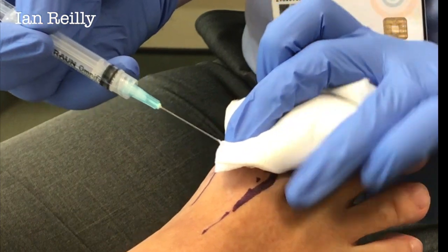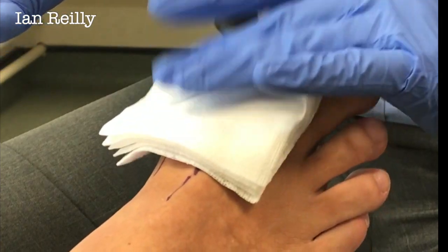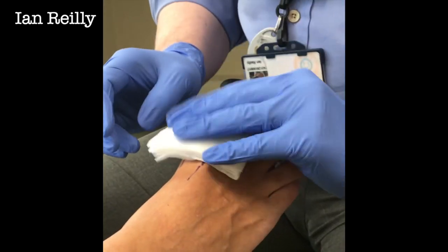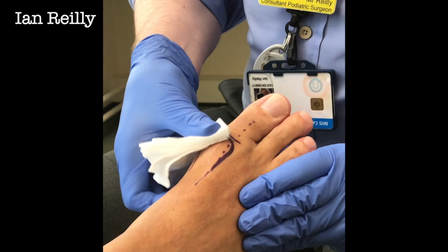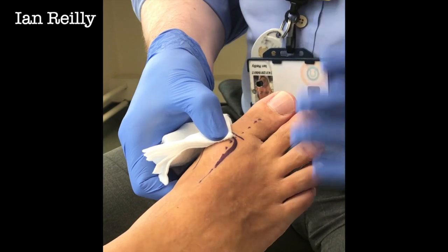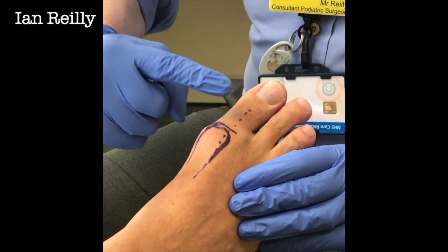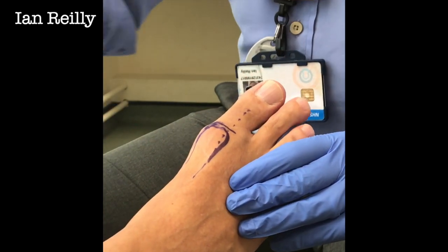3, 2, 1, off. A little bit of pressure on so there's no claret. Now I'm just going to show you — we don't resheathe needles. I've shown you this little tip before. This is just a nice way of getting rid of any sharpness. And that's it done. Thank you very much, fairly quick really wasn't it. Just check for any claret — no. And put a little dressing on there. Rule of thumb: no driving today because it can be a little bit sore. I don't want your driving to be impaired. Can be a bit stingy today and tomorrow, so take it easy. We'll see you in six weeks time for review. What I expect when you come back is we've got a bit more range of motion in the joint and you've got a lot less pain. Not cured, but better for a period of time.